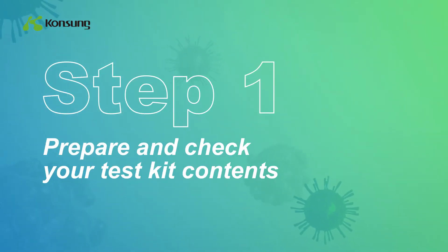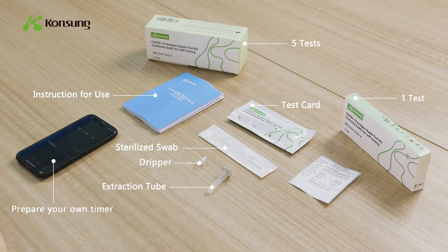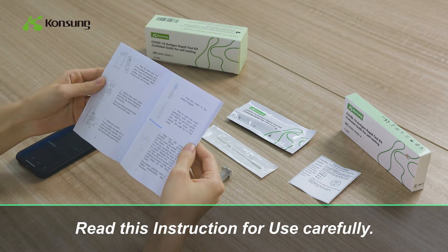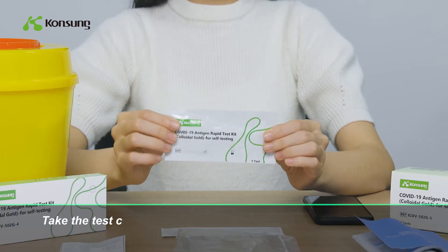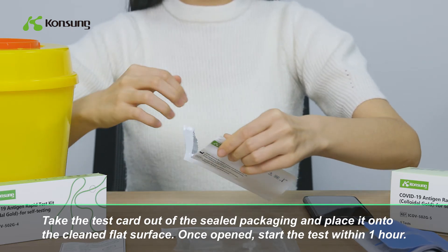Prepare and check your test kit contents. Wash hands thoroughly before taking the test. Read the instruction for use carefully. Take the test card out of the sealed packaging and place it onto a cleaned, flat surface. Once open, start the test within 1 hour.